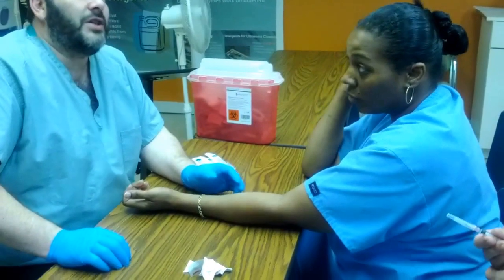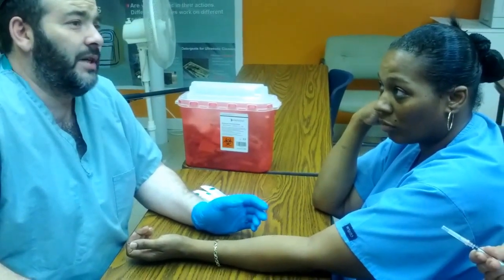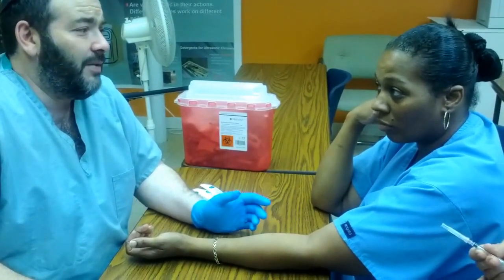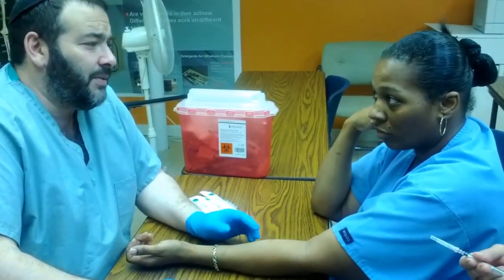Now, instructions to the patient. Make sure that after you've completed your TB test, you ask the patient to sit for 15-20 minutes after the injection in the lobby, just to make sure they don't have a severe allergic reaction. Also, you will draw a circle around the base of your injection so you know where to find it later on, and ask the person not to wash it, smear it, or do anything else with the bubble.